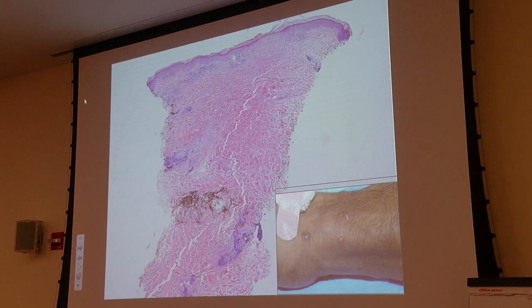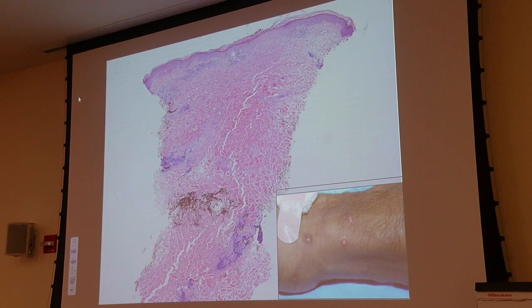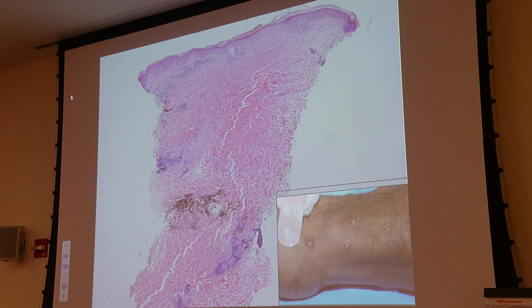And this is a punch biopsy. I'd like to say it's actually Roger's biopsy, that basically it's a punch biopsy through one of these porcelain plaques. And you can see the porcelain area corresponds to this central zone of dermal fibrosis with hypovascularity and frank avascularity with true vascular dropout. And the erythematous rim is really an active border. It demonstrates the active endotheliolitis with a variable lymphocytic infiltrate. And so that would really define the sort of reddish border that we see if one is to have a punch biopsy of one of these lesions.